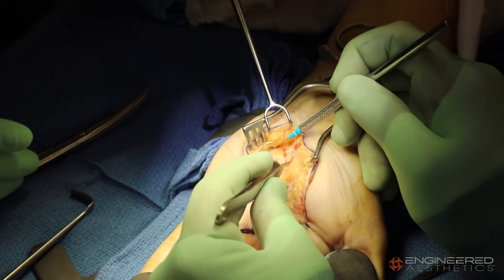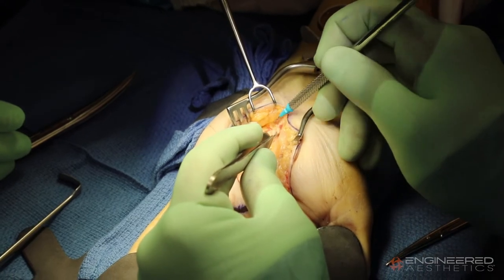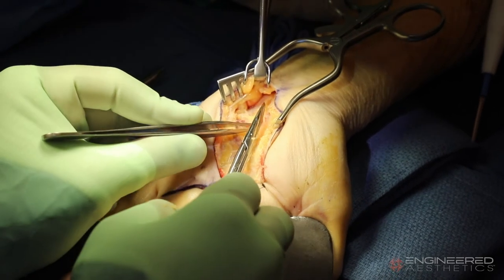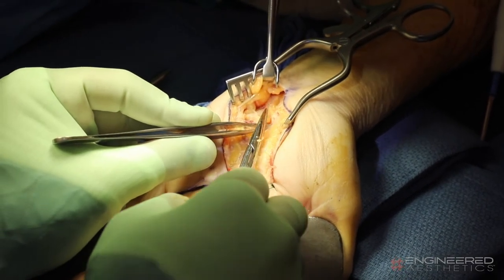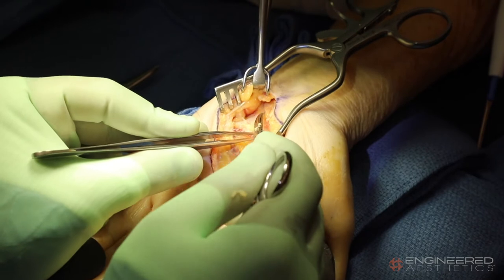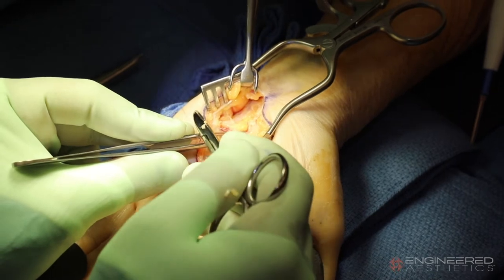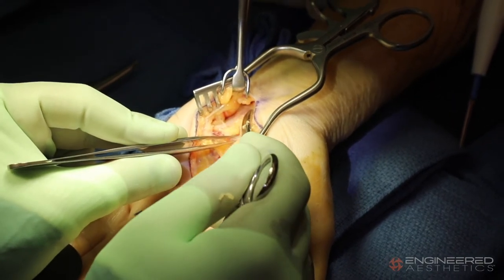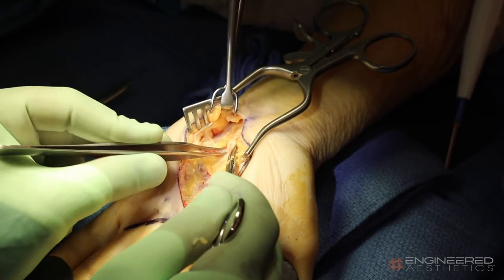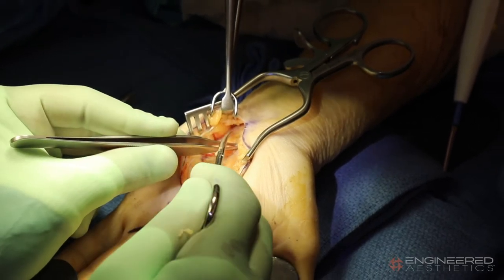On the other side of that is going to be the ulnar nerve. My main goal here is just to decompress the entire tunnel. I'm being very cautious with my dissection. I have now completely released Guyon's Canal. Here's the ulnar artery — on the other side of that vessel is the ulnar nerve, which has been giving the patient problems of peripheral compression neuropathy, particularly numbness and tingling involving the small and ring finger and some weakness in the intrinsic muscles of the hand. But it's completely released. And here you can see the roof of the carpal tunnel making up the floor of Guyon's Canal.